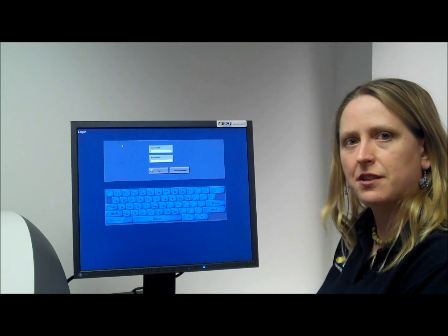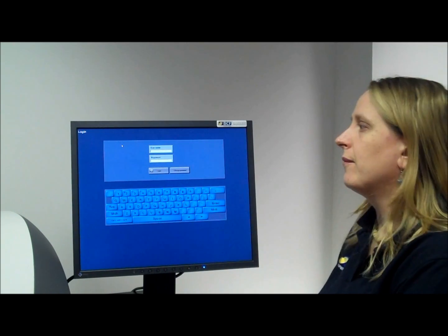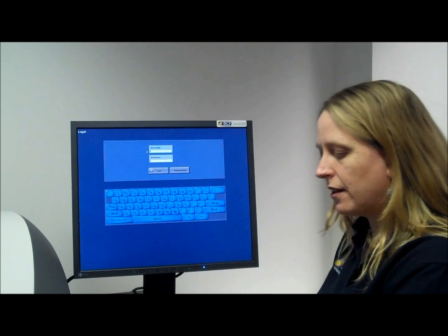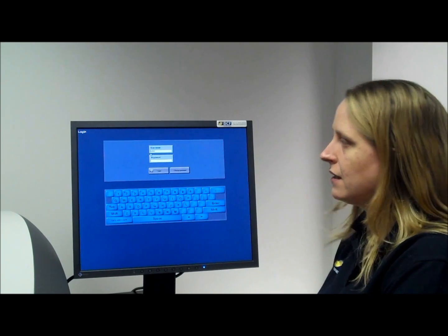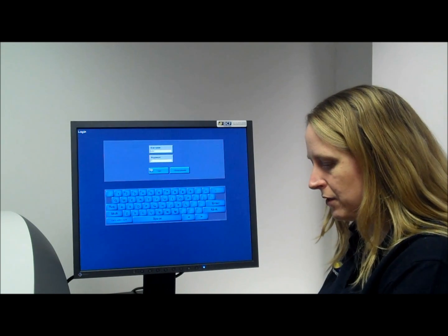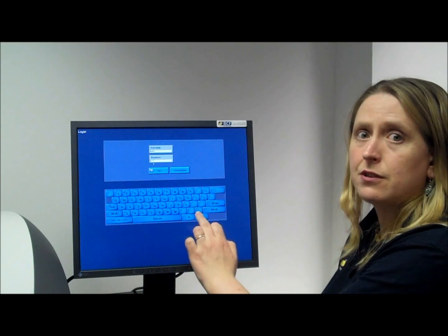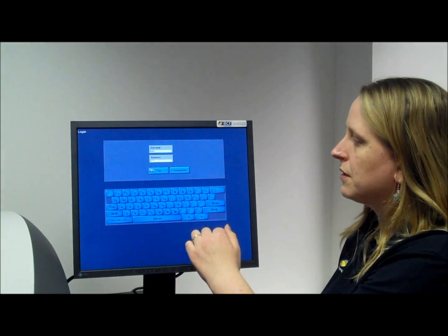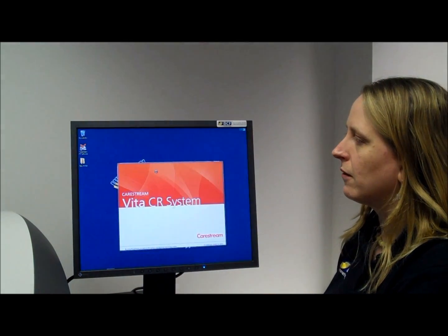So now your system's powered up, you need to log in and just type in the login details and password that we gave you. If you have a touch screen computer, you can use the virtual keyboard at this point, and then just click login.